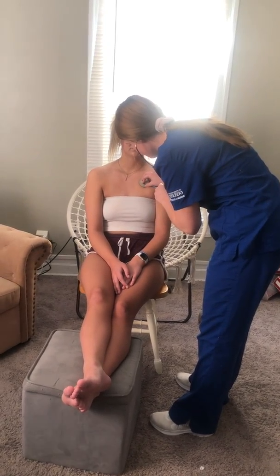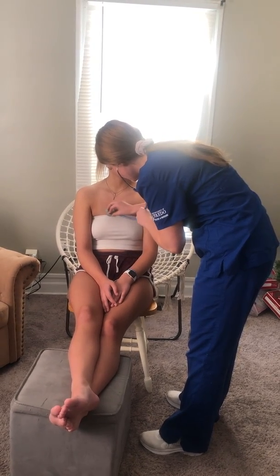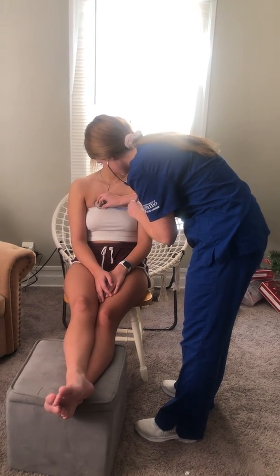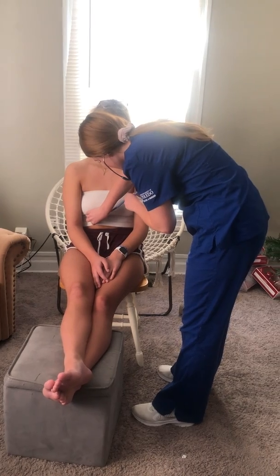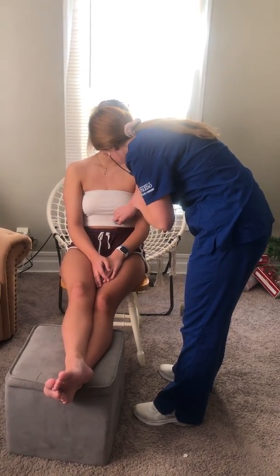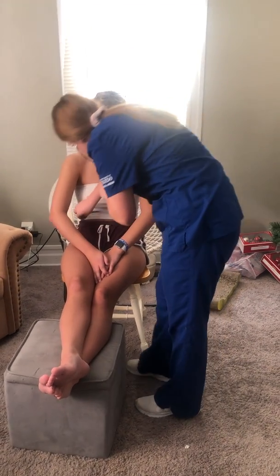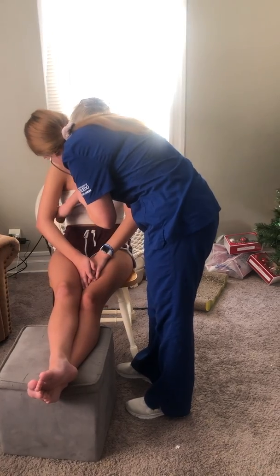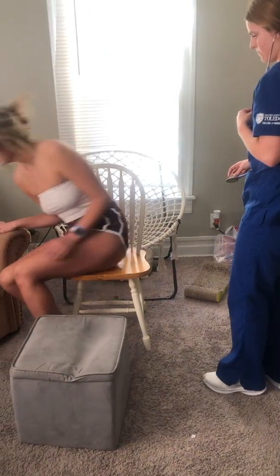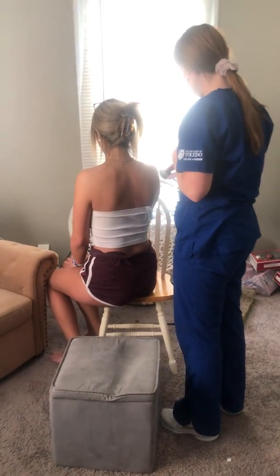Deep breath. Deep breath. Deep breath. All right, and deep breath. All right, can I have you turn around for me now, Morgan? All right, and same thing, I'm gonna have you take a deep breath every time I move my stethoscope.